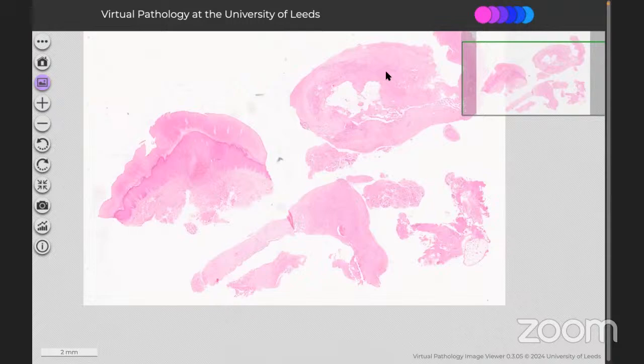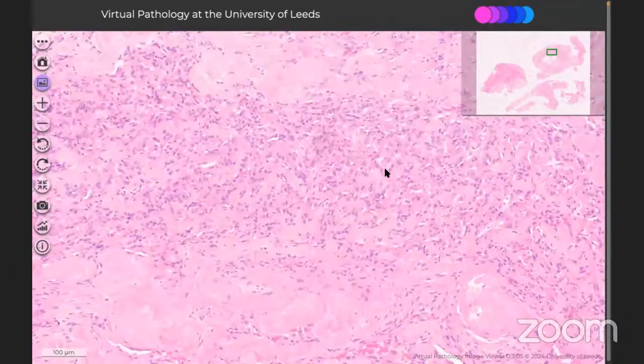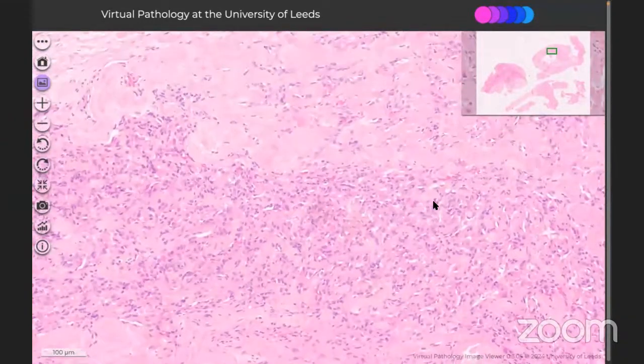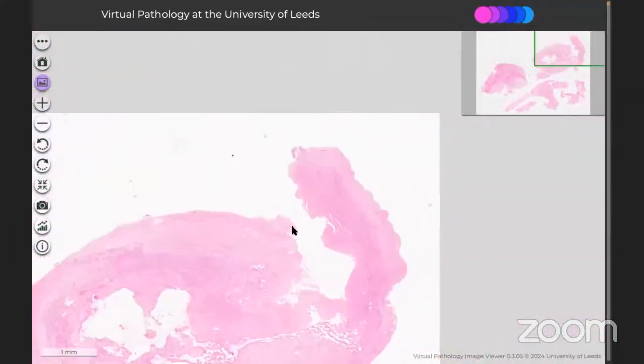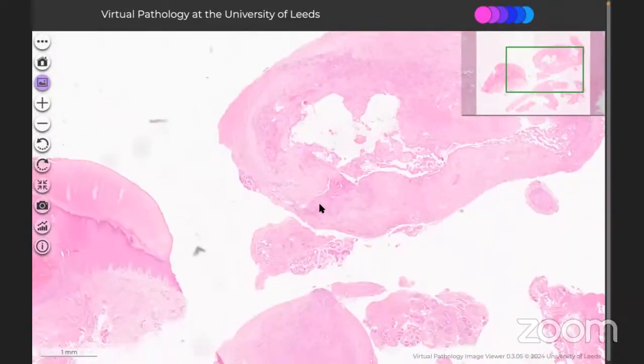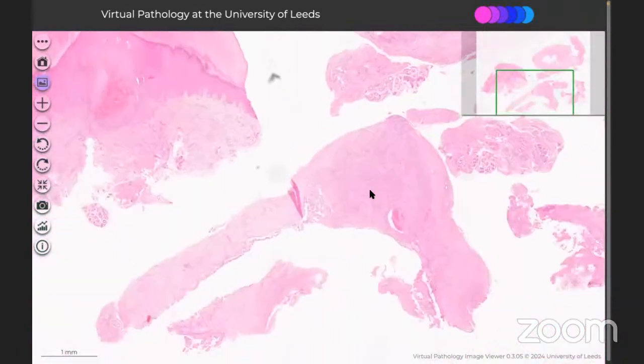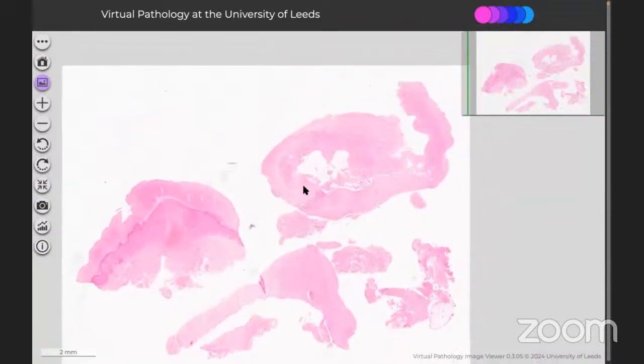Okay, and you can say that I don't consider angiosarcoma per se, and you can say that this will be CK negative and the vascular markers will be positive. CD31 and D2-40, this kind of marker will be positive. Okay, so this is how you can say that even though the IHC is not required, these are the markers that can come positive. Okay. So this is Masson tumor, also known as papillary intravascular endothelial hyperplasia. Okay.